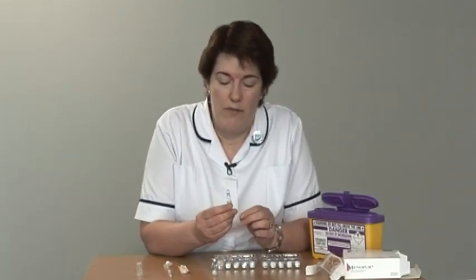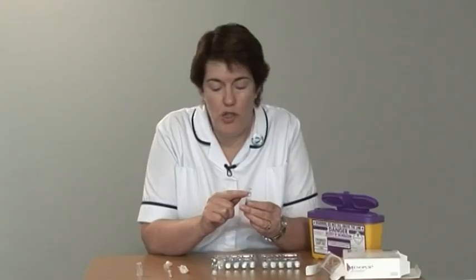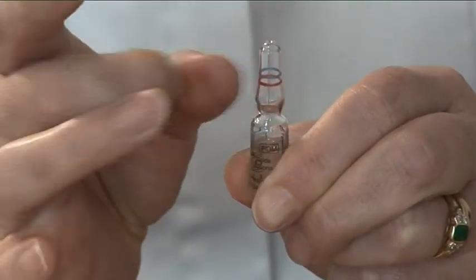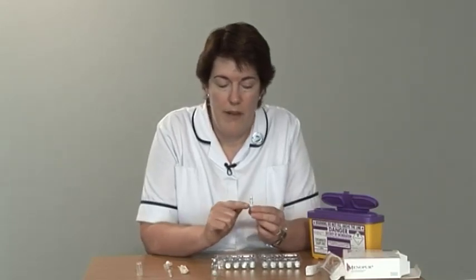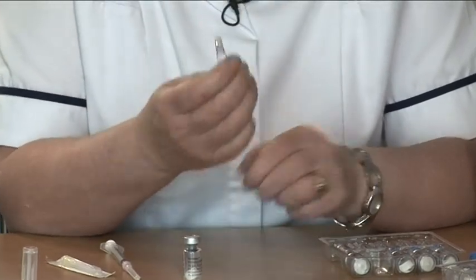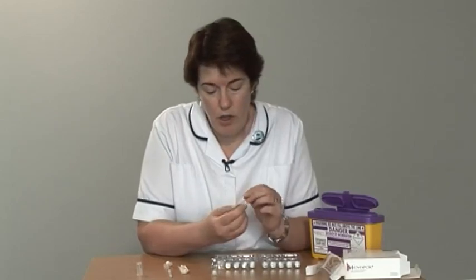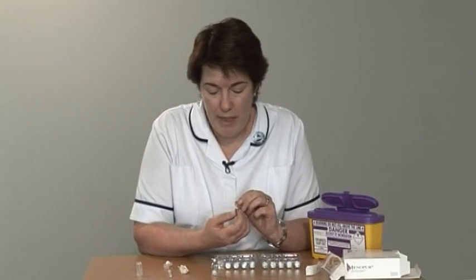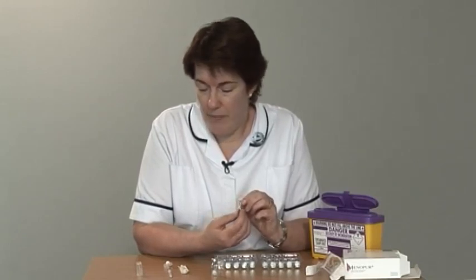Take your vial of diluent. If you have diluent in the top of the vial, you need to ensure it's all at the bottom. So just flick the top carefully with your finger to ensure the fluid drops down into the bottom. If it doesn't drop down immediately, just rotate the ampule with a circular motion and then flick it. You will see there is a blue dot on the top of the vial. This is the weak point in the top and is where it will snap.